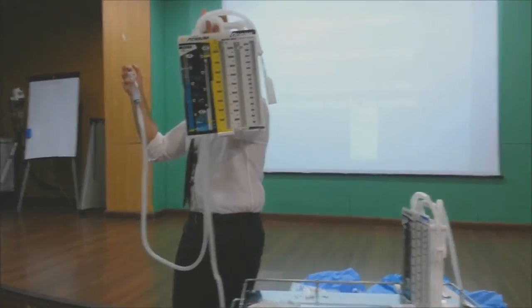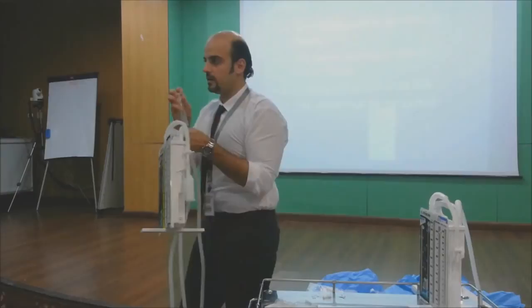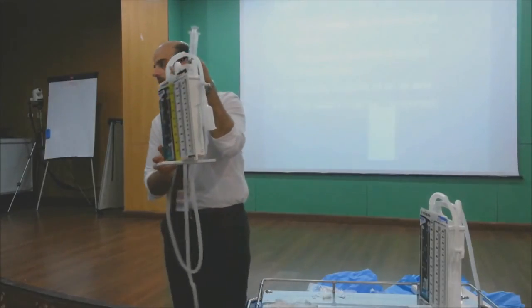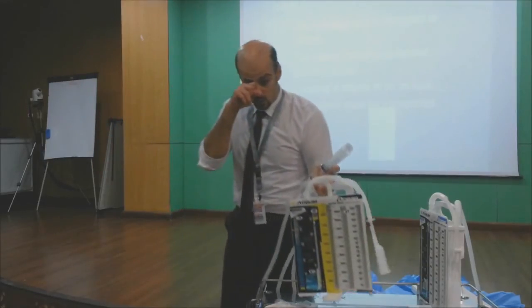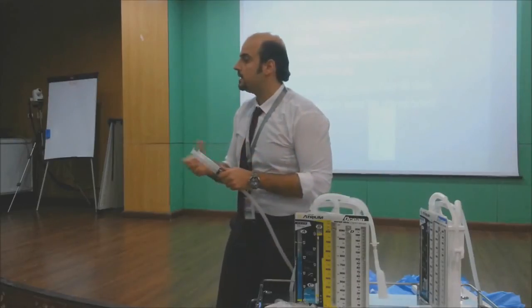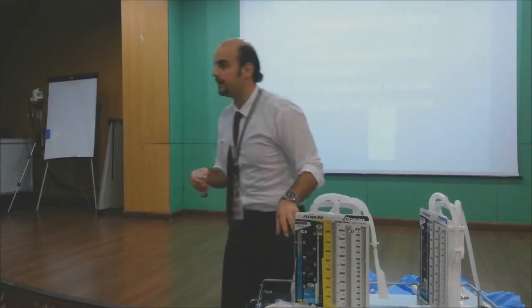You see the air leak now? It's here in the underwater seal. This is an air leak. But these bubbles are not an air leak. The air leak is only here. Okay? Again, when I say minus 20 negative suction, is it from the wall suction? No, it's only here.